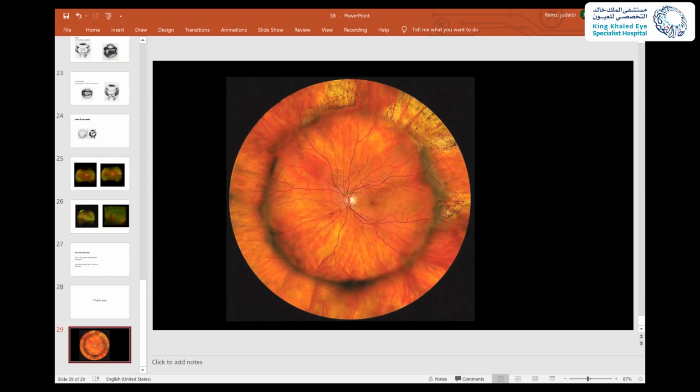Yeah, I have to agree with you 100%. For teaching purposes, it is ideal. And that argument of converting the extraocular surgery into an intraocular procedure once you open a chandelier port, I don't think it's justified. Like you mentioned, you have to do paracentesis in some cases. Some cases you will have to do external drainage of the subretinal fluid. So it's not justified to me.